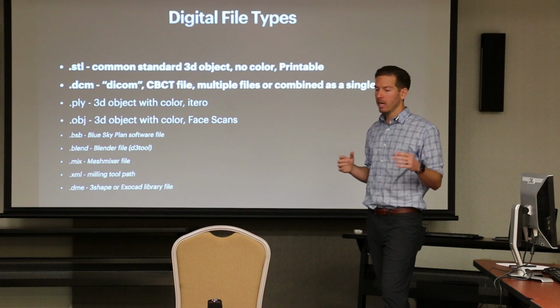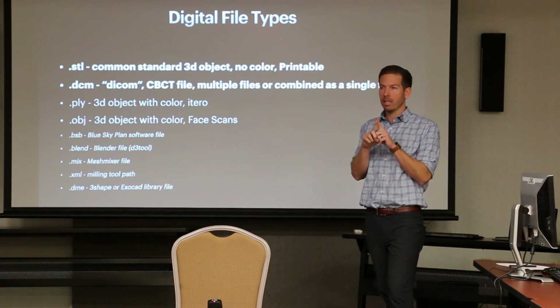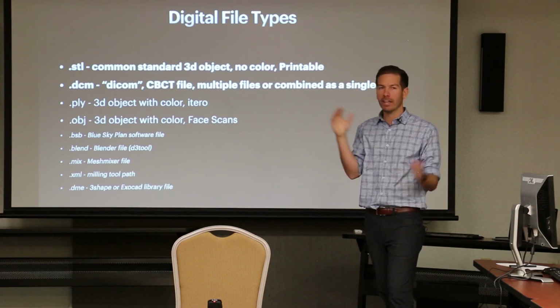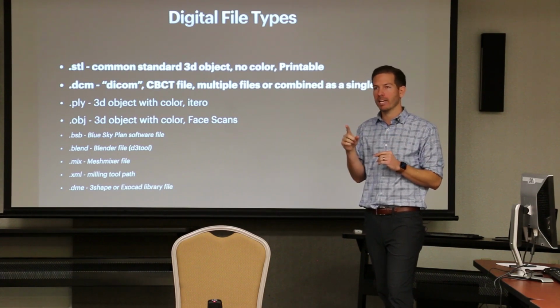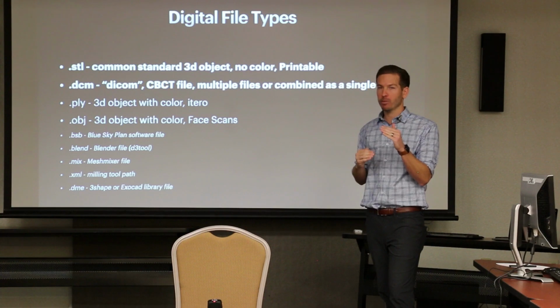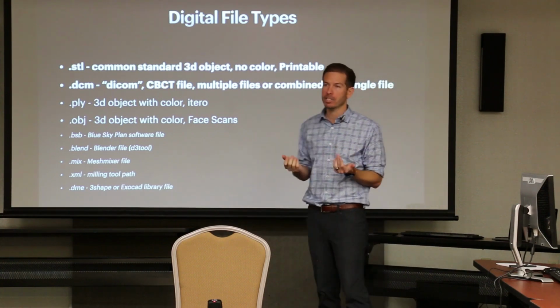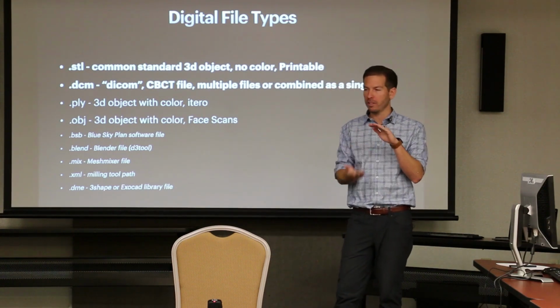A cone beam can produce it as a single file, one file that's all packaged together, and you can move it around. It's all the cone beam in one. Or sometimes the cone beam will export it as 1,000 individual files in a folder. Blue Sky can work with either of those, but I think it's easier to export as a single file because there's no reason to have all these files in a folder.